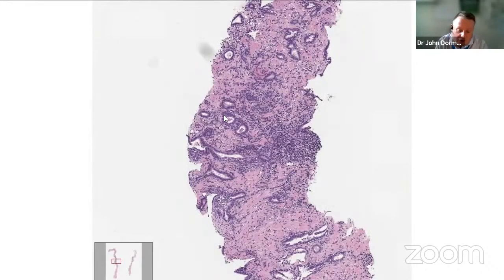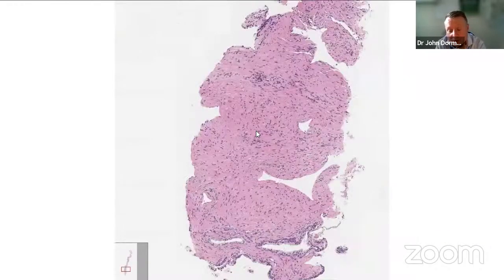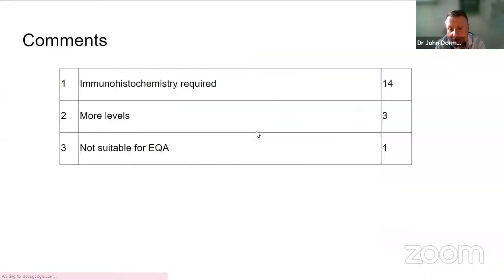That was the area; the picture's just rotated around. So there are some glands that look a bit atrophic, a bit dark, with lots of inflammatory cells around them that look kind of ductocentric, mostly lymphocytes but probably a few macrophages in there. There's some stromal overgrowth potentially. That's difficult to say in a prostate biopsy, but lots of stroma, not many glands.